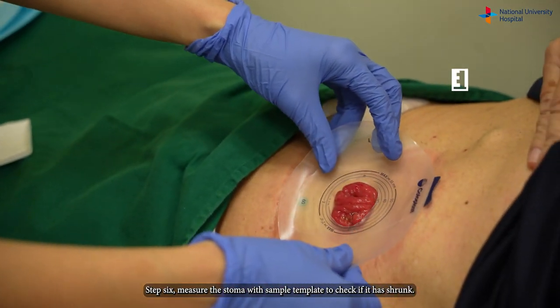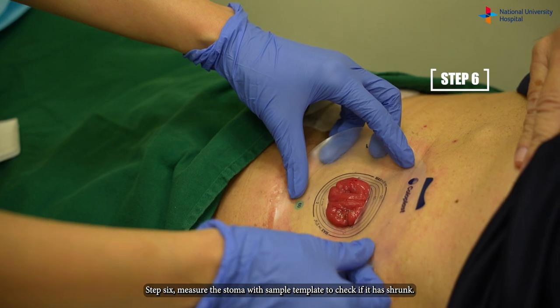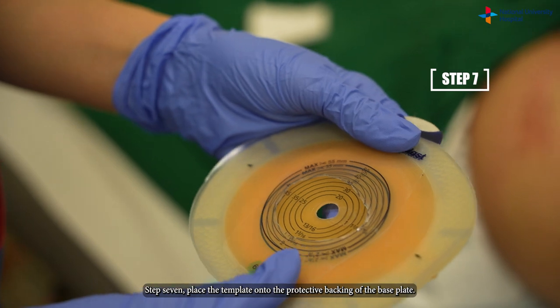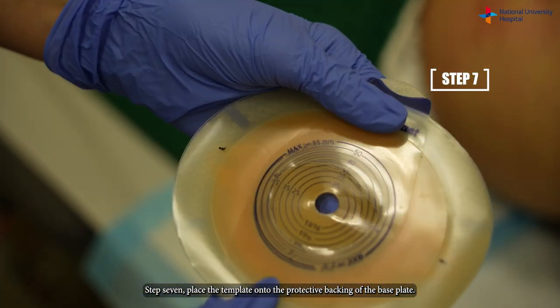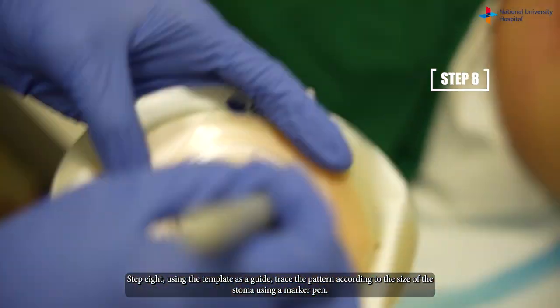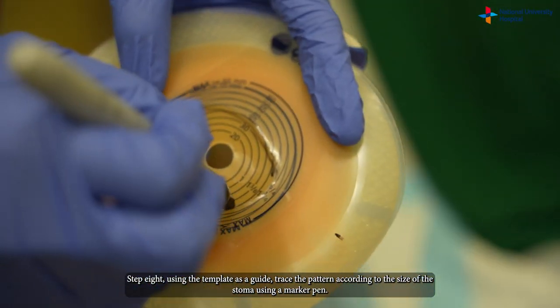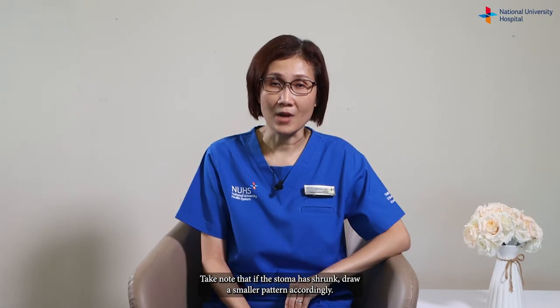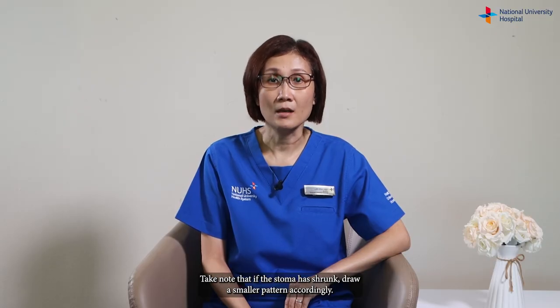Step six: measure the stoma with a sample template to check if it has shrunk. Step seven: place the template on the protective backing of the base plate. Step eight: using the template as a guide, trace the pattern according to the size of the stoma using a marker pen. Take note that if the stoma has shrunk, draw a smaller pattern accordingly.